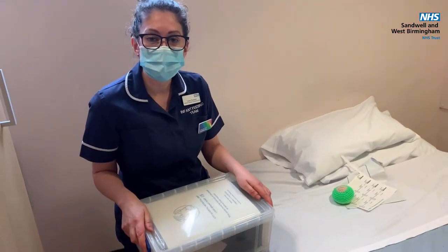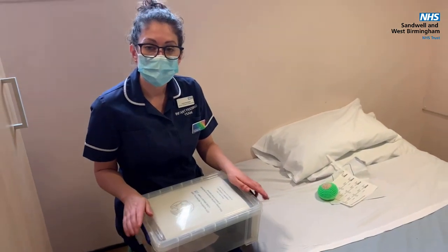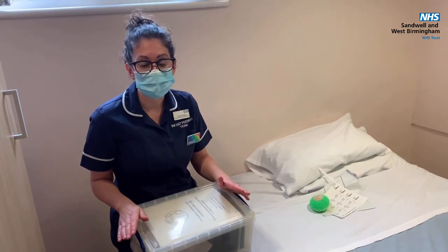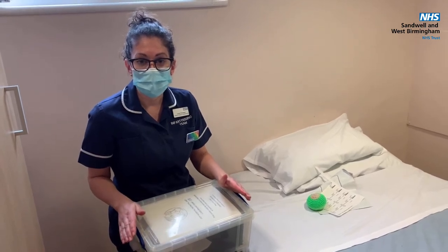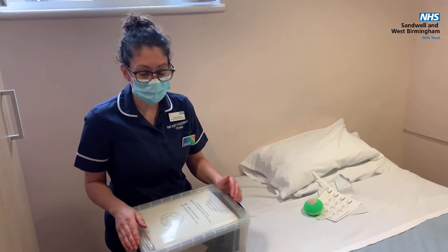Hi, my name is Louise Thompson and I'm part of the infant feeding team at City Hospital. If your baby comes to the neonatal unit at City, we have got breast pumps available that we can loan to you for the time that baby's on the neonatal unit, to help you establish and provide a milk supply for your baby.